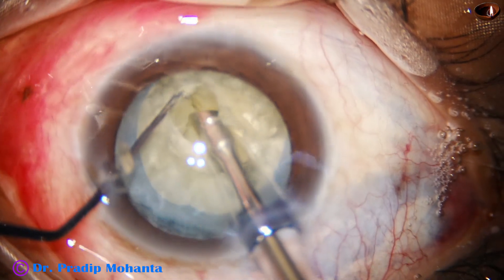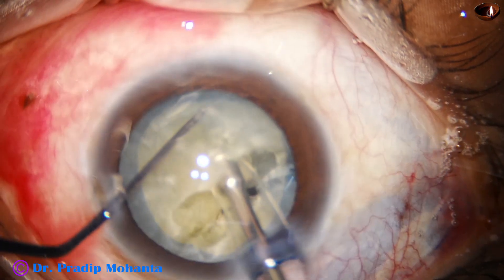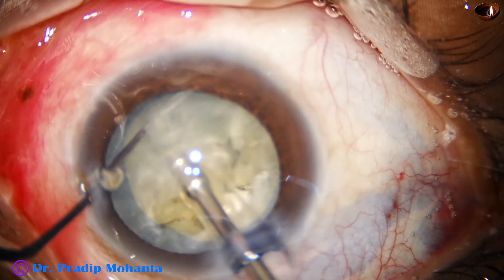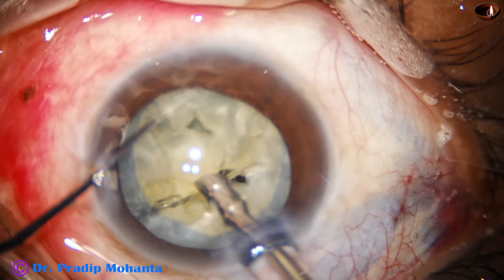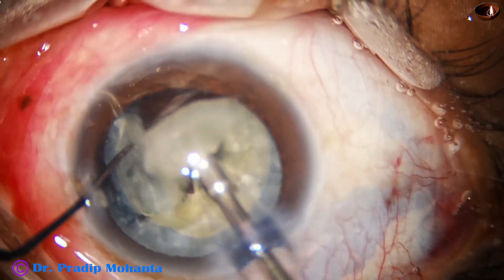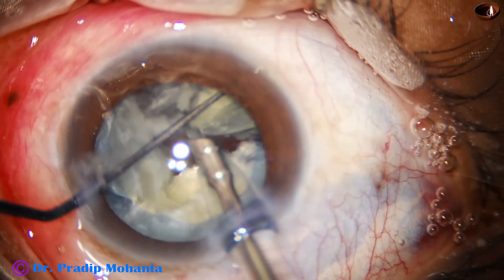Come to the other side. Rotate 180 degrees. Hold the heminucleus and separate the other heminucleus completely. This heminucleus I am planning to divide into three pieces. At this time I caught the iris margin immediately — I released. We have to train our foot to develop sharp reflexes. Even if we catch the posterior capsule, we should be able to stop immediately and release the capsule by reflux.